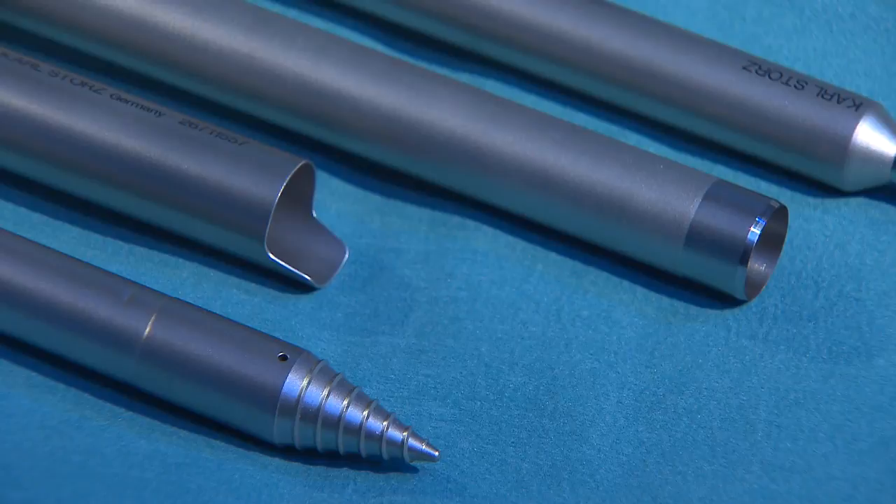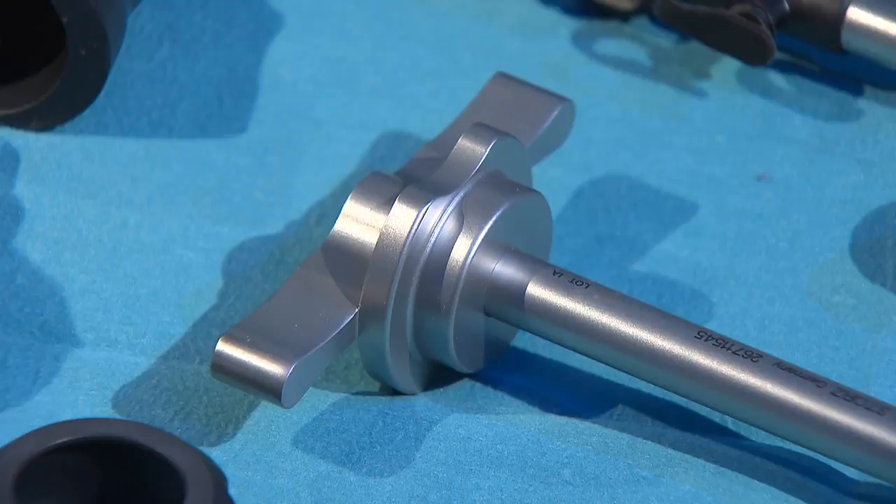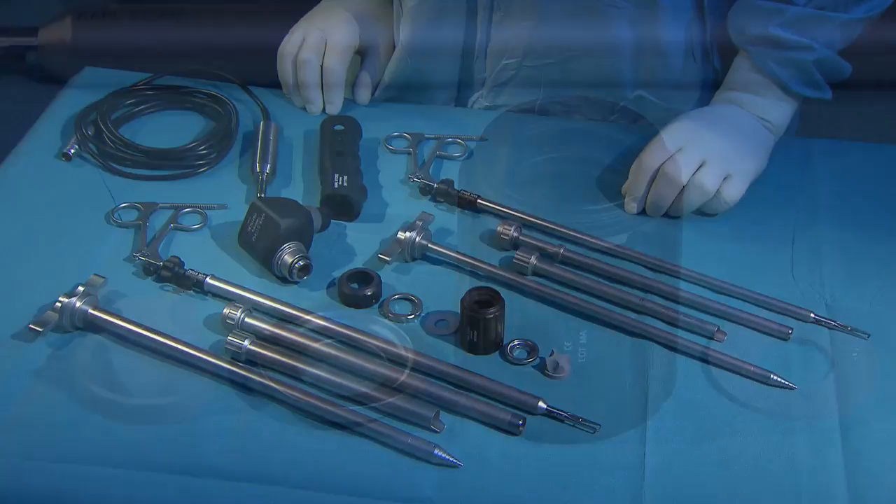The development of morcellators has solved these problems. The newly developed supercut morcellator represents a new class in terms of safety, flexibility of use, simple handling, and harmonious ergonomics. It combines unbeatably effective power and power settings with ergonomics, and is a highlight among morcellator systems.